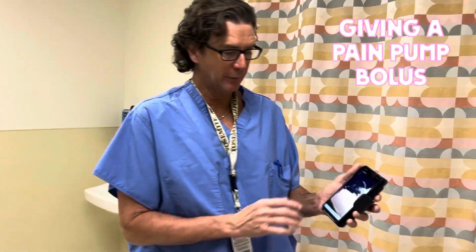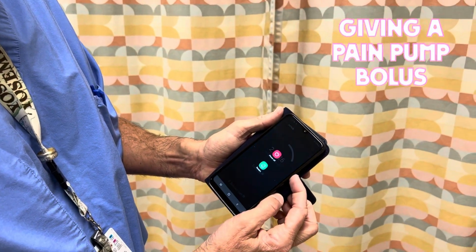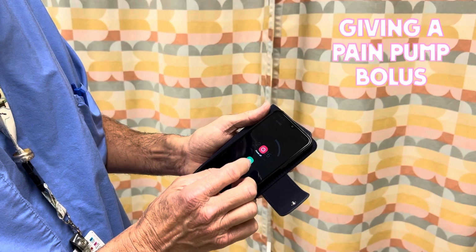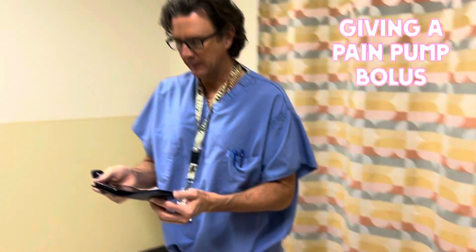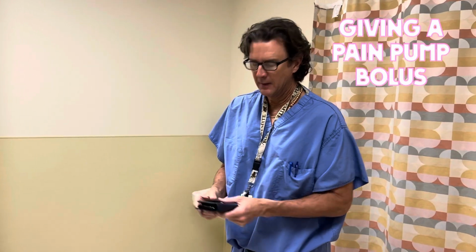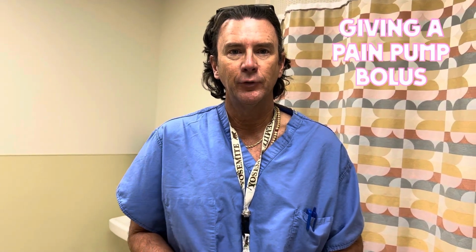So when you're done giving the bolus, you always want to press the button on the side, power it off, and then both are turned off. That's the way you give a bolus, that's the way you tell how much is left, and that's the way you tell at what rate you're going. So that's your Medtronic intrathecal pain pump.